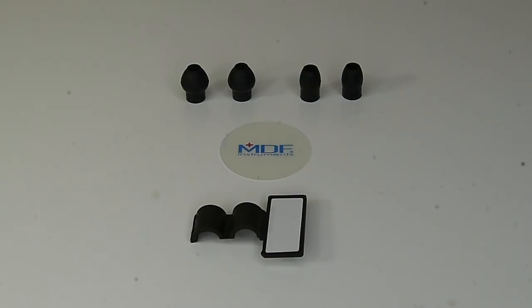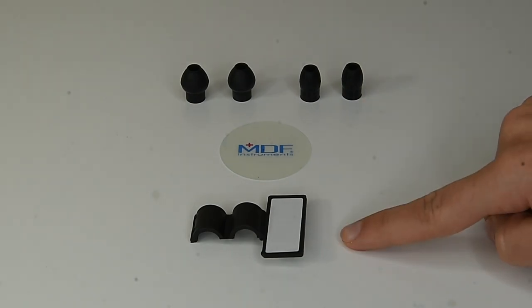The spare kit included with this stethoscope is pretty good. You get two sets of eartips — one extra large and one small — the medium size comes with the stethoscope. You also get an extra diaphragm and a name tag that you can click onto your stethoscope. I've given it a three and a half out of five.